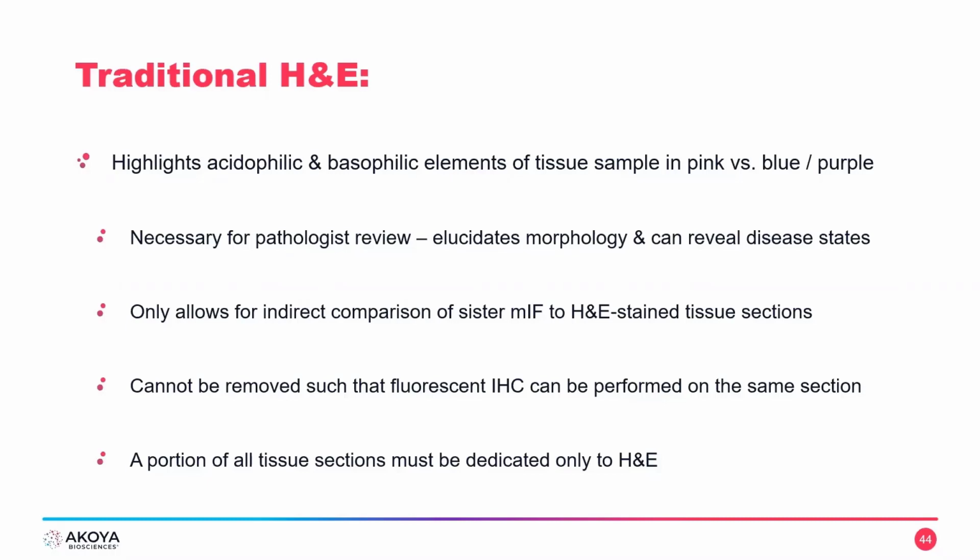And a portion of all tissue sections must be dedicated only to H&E, obviously. Depending on your study requirements, that could be one tissue section or a greater number of tissue sections dedicated only to this particular stain.